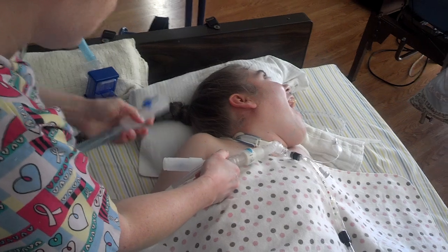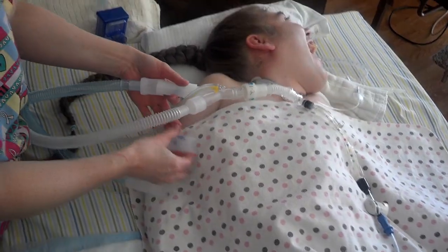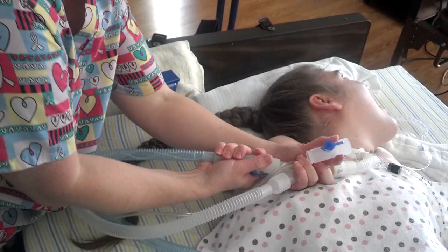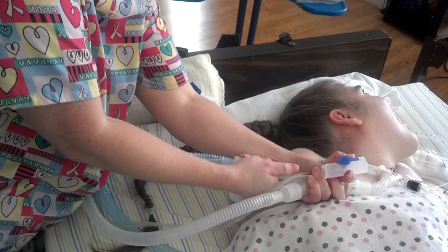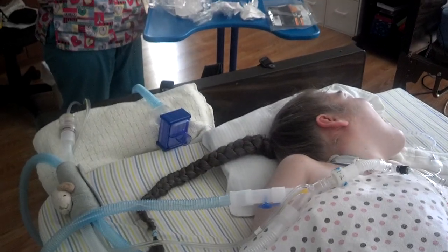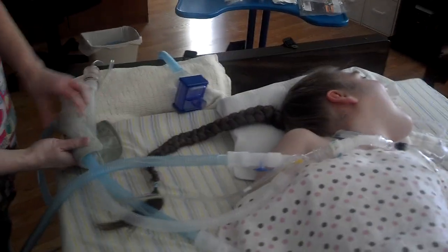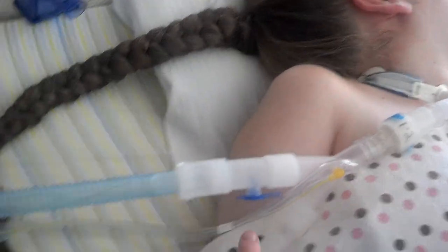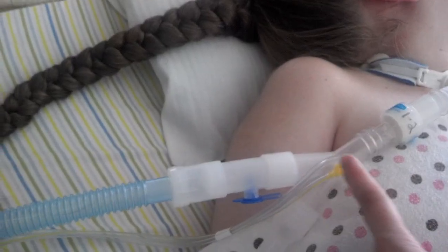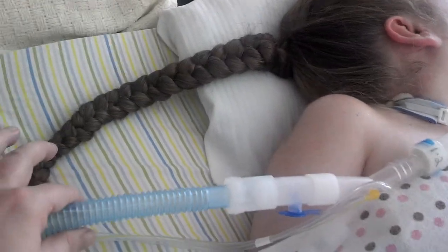That obnoxious noise is to be expected. This part is tight. That's going to have to be changed when you do the Y. We had a little difficulty — this Y connector is actually part of the white tubing. The meter dose inhaler adapter was kind of stuck on this side of the Y joint. Since we have to change all of that anyway when she changes the white tubing, we just left it on there with the new blue connected to it. So now she's getting the white out. We refer to things as colors quite often — we know they have other names.